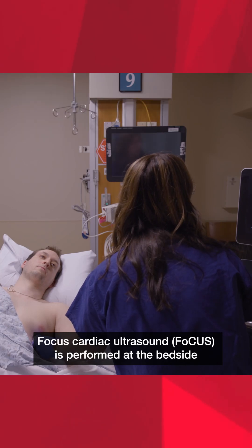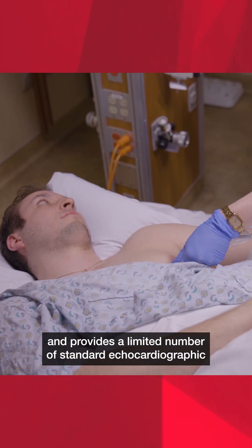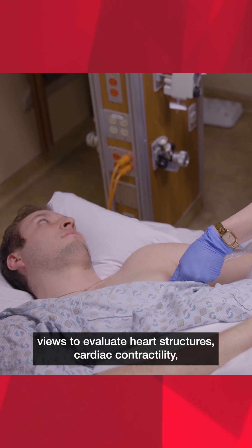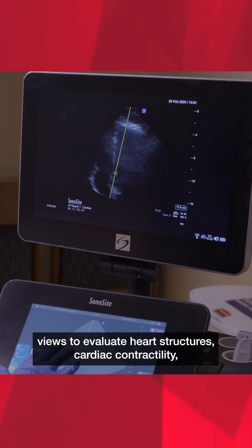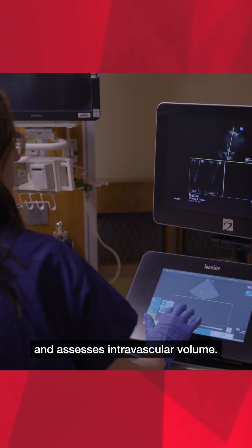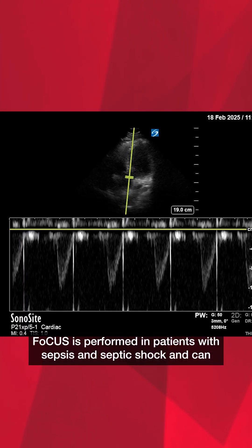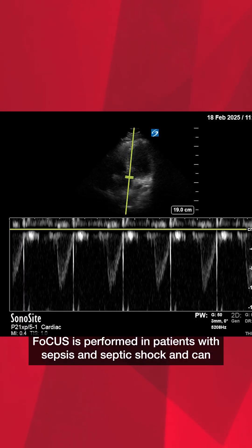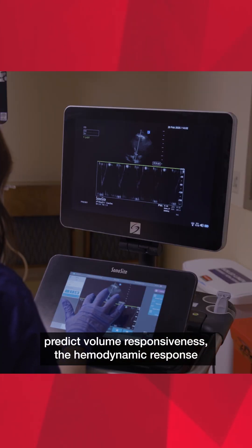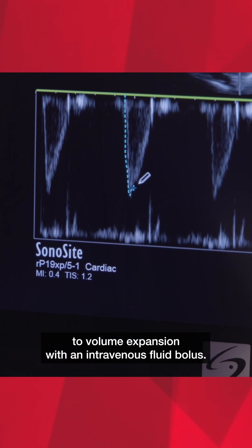Focus Cardiac Ultrasound is performed at the bedside and provides a limited number of standard echocardiographic views to evaluate heart structures, cardiac contractility, and assesses intravascular volume. Focus is performed in patients with sepsis and septic shock and can predict volume responsiveness — the hemodynamic response to volume expansion with an intravenous fluid bolus.